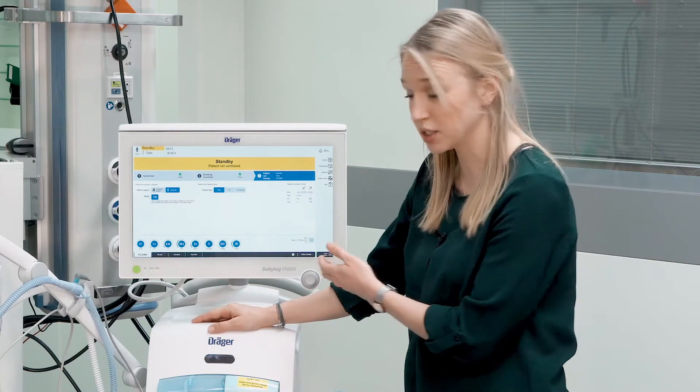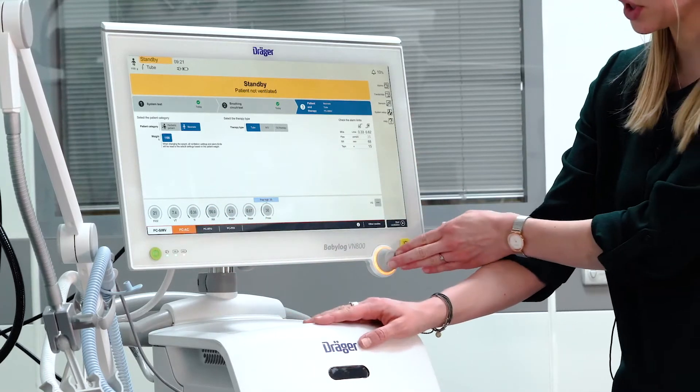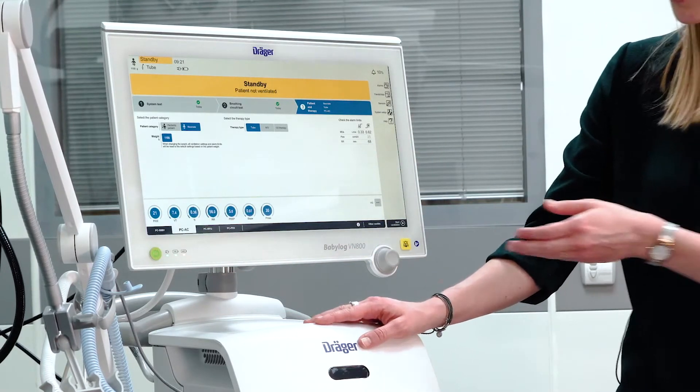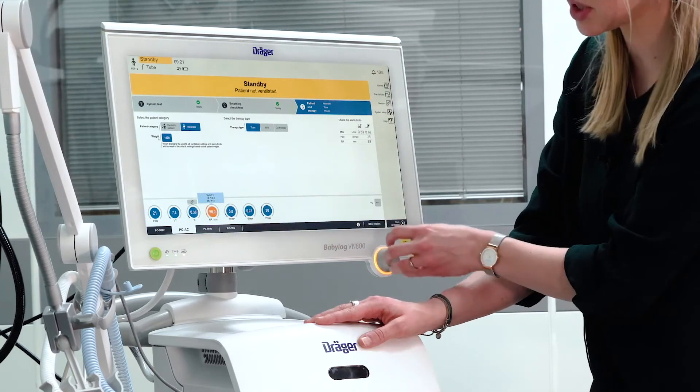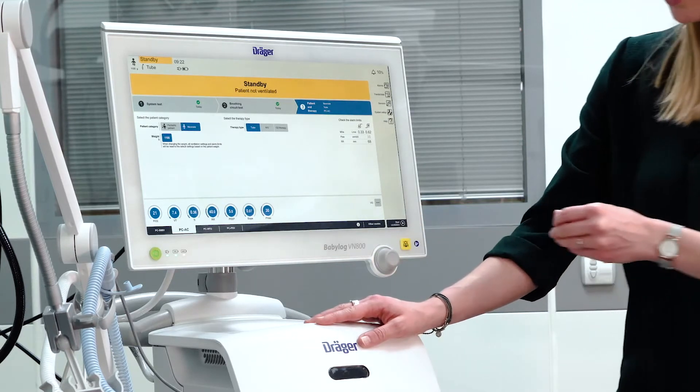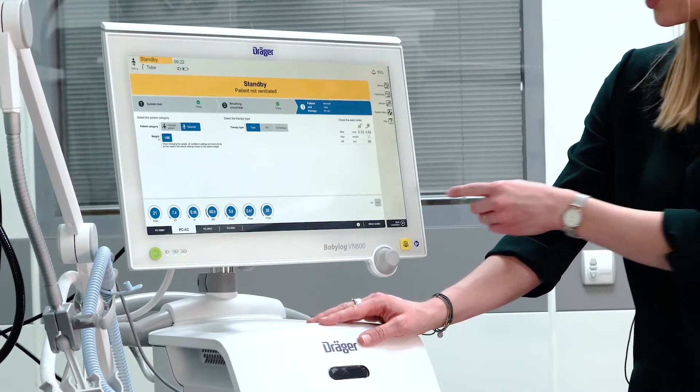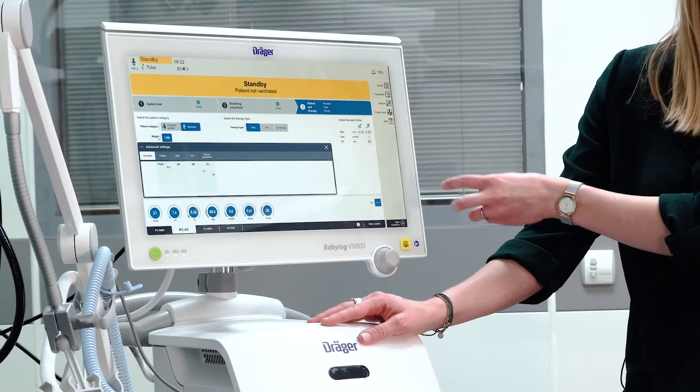If you want to start in a different ventilation mode, please select the ventilation mode and confirm by pressing the rotary knob. If you want to change specific parameters, select the specific parameter, turn it to the desired value, and confirm with the rotary knob. Further additional settings can be accessed via the three dots at the side.